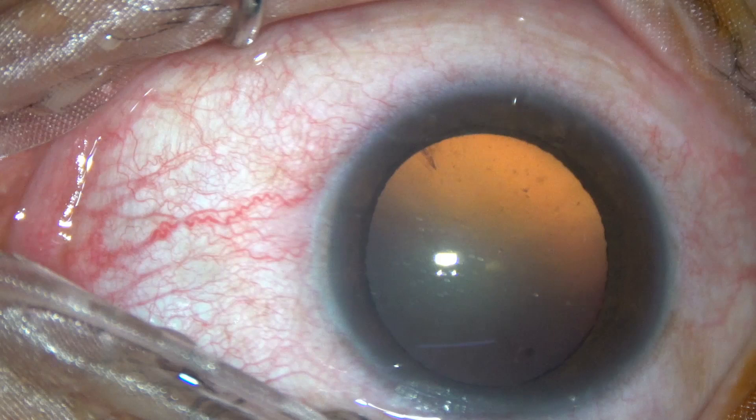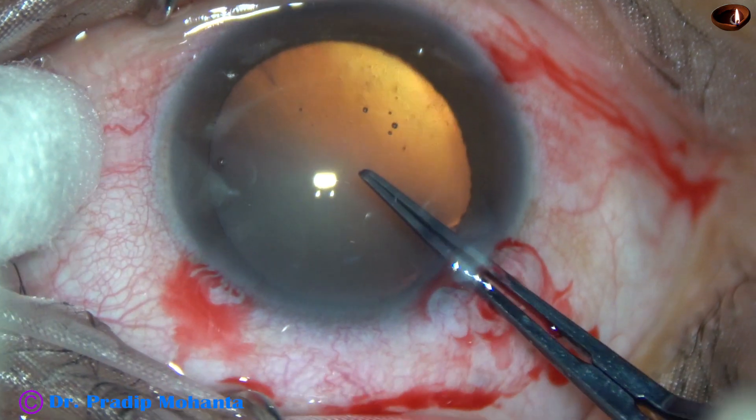Friends, this is a soft cataract in a very high myope. Let's see this edited video.